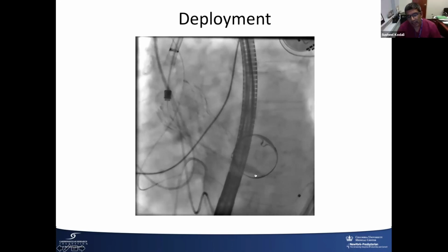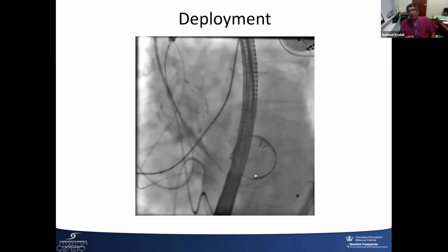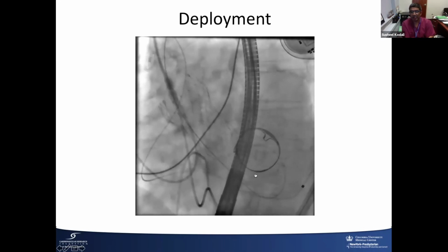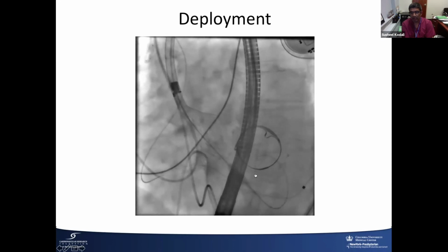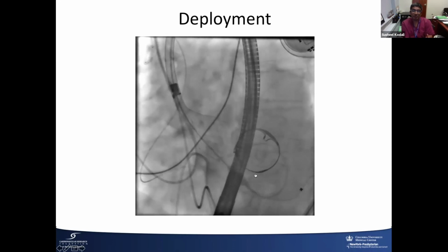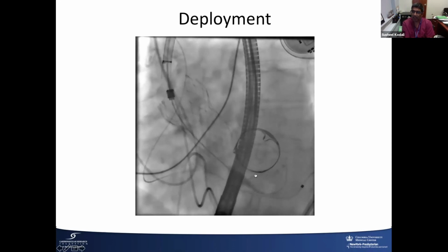So I agree. In general, we're slower. In AS, we're definitely slower. The bottom part of the valve had been in for a while, and for the most part I thought it had been in well. The TE here helped quite a bit for me. One, we were resizing. We could really see the position landing down on the annulus.